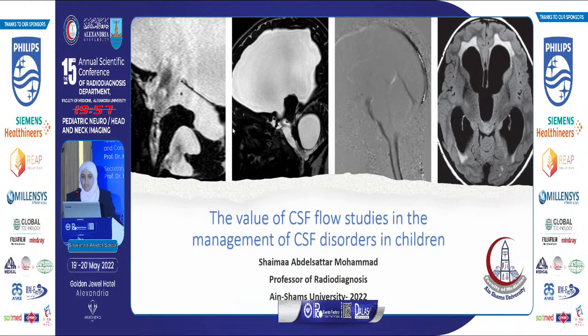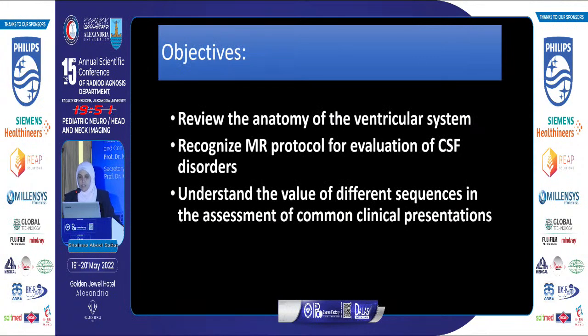I will talk about the value of CSF flow studies in the management of CSF disorders in children. My objectives are to review the anatomy of the ventricular system, recognize the MR protocol for evaluation of CSF disorders, and understand the value of different sequences in the assessment of common clinical presentations.